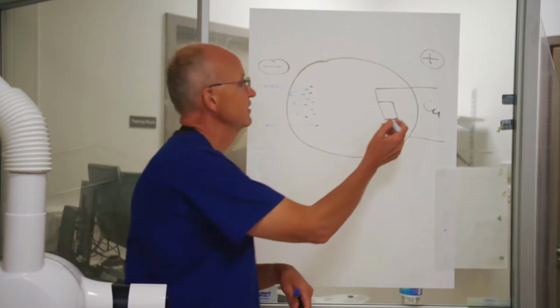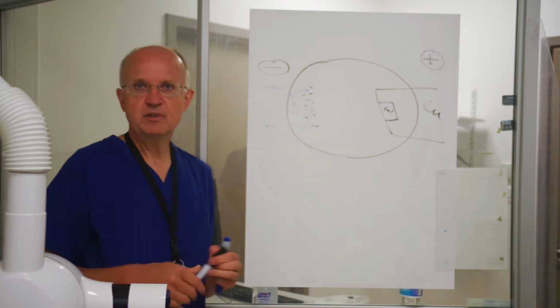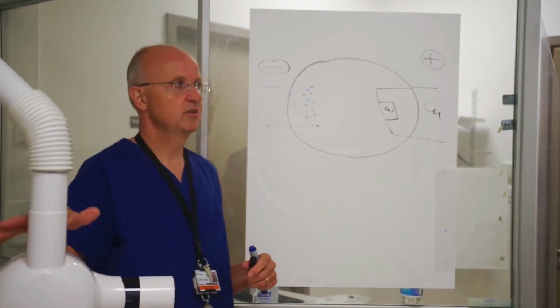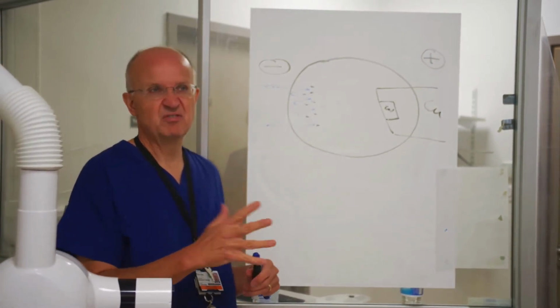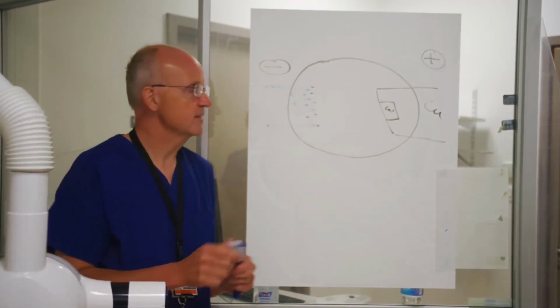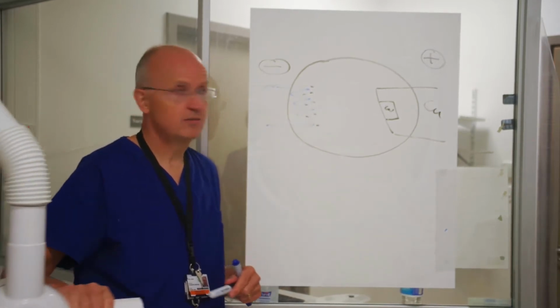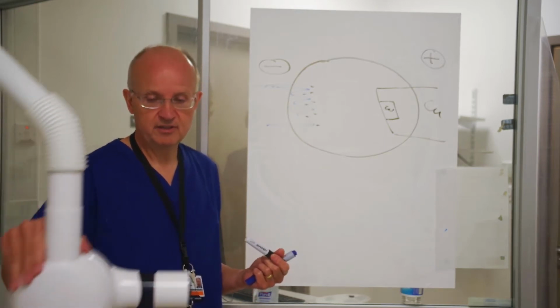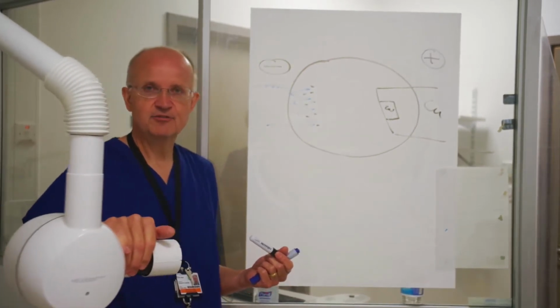We'll come back to the reason for tungsten in a minute, but tungsten has the chemical symbol W. If we were looking at soft tissue, and an example is breast tissue, we wouldn't be using tungsten, we'd be using molybdenum, because that's better at producing X-rays at a lower energy, around about 35 or so. But tungsten is particularly good around 70, so that's why we choose it. If you're looking at aircraft wings and things like that, you may use other materials, you may use copper. So it really does depend. But what has been designed for you is a nice little X-ray tube that Mr. Rodkin would remember, and it's got tungsten in it.